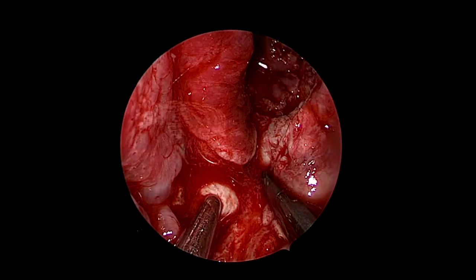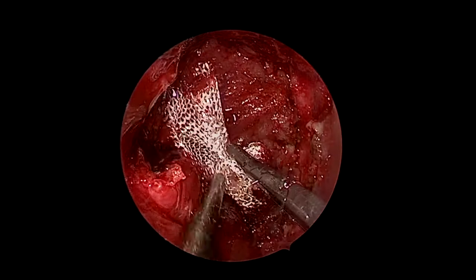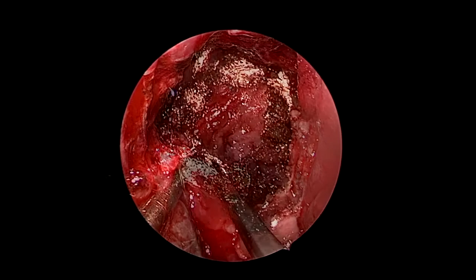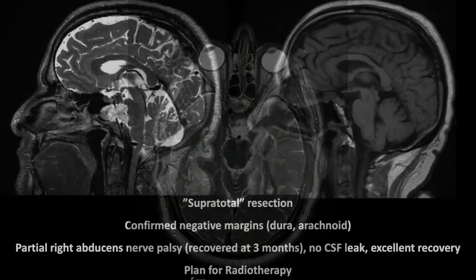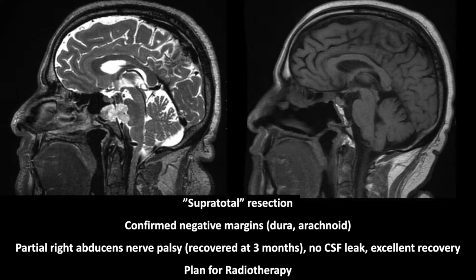We use ICG to confirm that there is good vascular supply on the pedicle of the flap, which is key for a successful reconstruction. We secure the septal flap with layers of Surgicel, framing the contour of the nasoseptal flap. This is the post-operative MRI at three months — the patient had a supra-total resection with confirmed negative margins. He developed a partial 6th nerve palsy that has completely recovered at three months, with no other complications, excellent recovery, and plans for radiotherapy. Thank you.